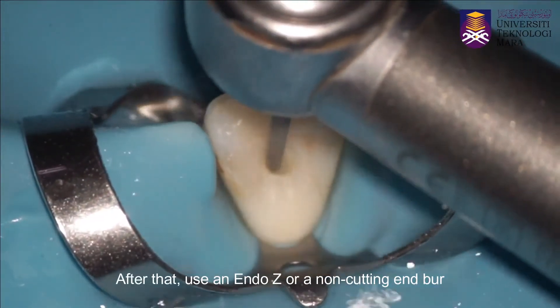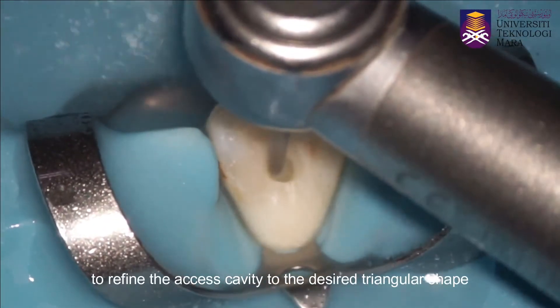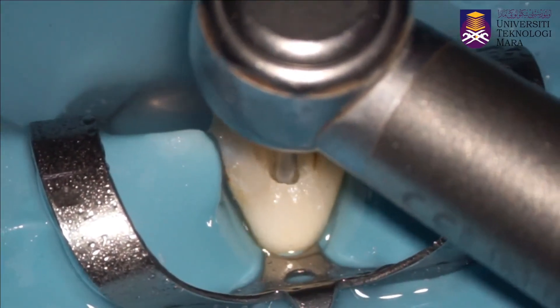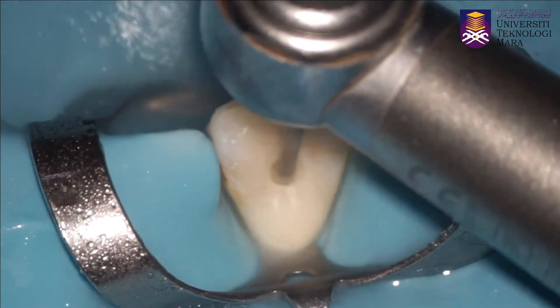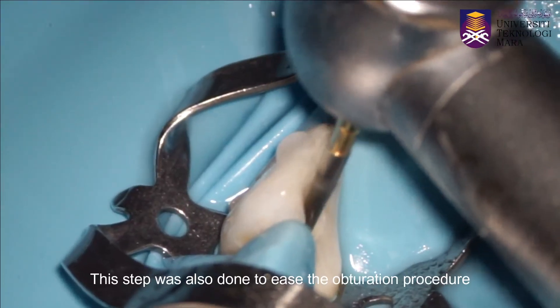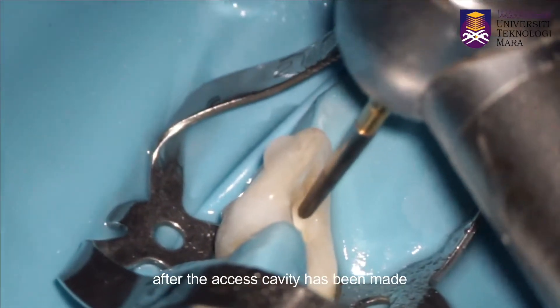Use an endoz or a non-cutting end burr to refine the access cavity to the desired triangular shape. This step was also done to ease the obturation procedure after the access cavity has been made.